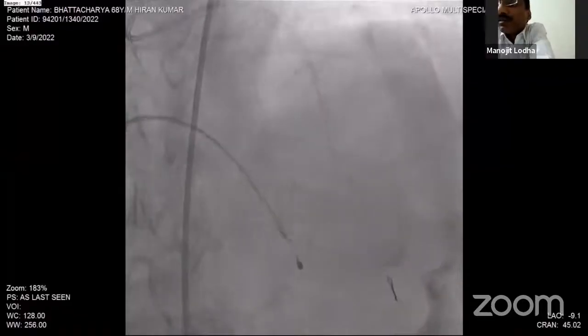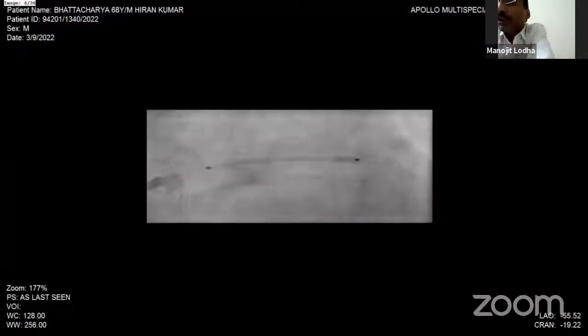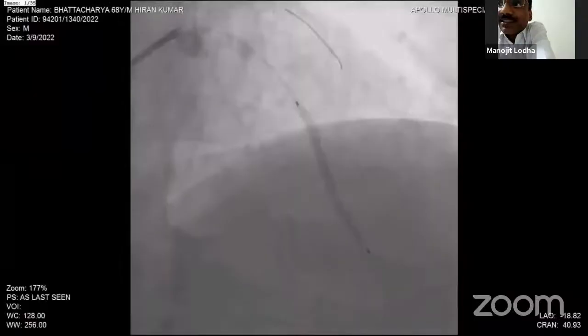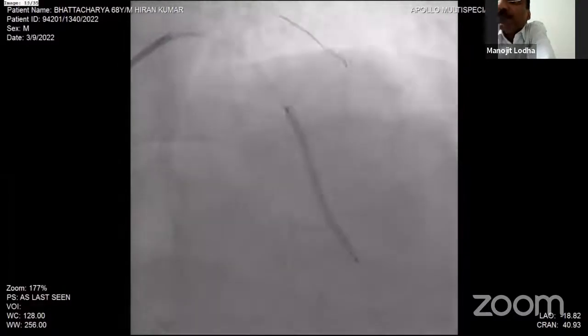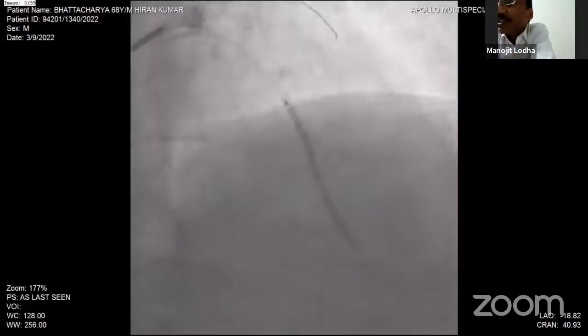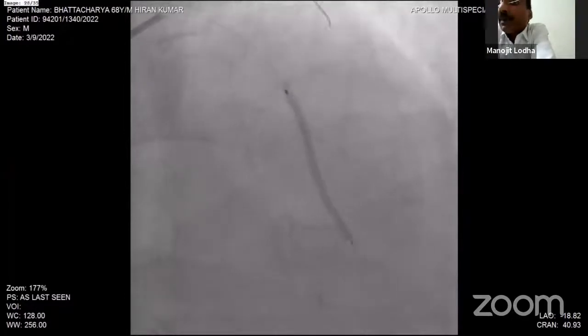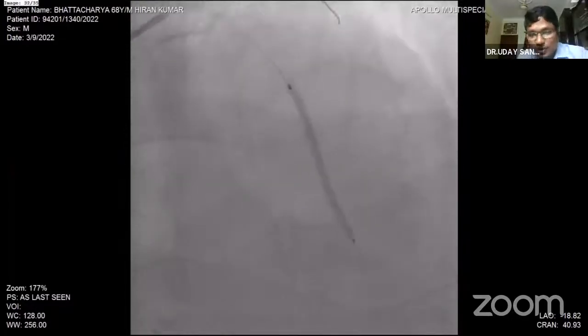Okay, so actually what happens is that if after putting one stent or even after ballooning you are not getting good flow, then I would suggest first establish good flow before putting a stent. Many persons put the stent in the hope that the flow will be good, and there will be no flow. That is not a good idea in angioplasty. In angioplasty, I always suggest to first have good flow established, see the distal target vessel well, and then put a stent in the distal vessel. And if flow is not coming, better to put the patient on GP2B3A overnight, or otherwise you can give it. But still, after the proximal and distal stent, the flow was not bad.